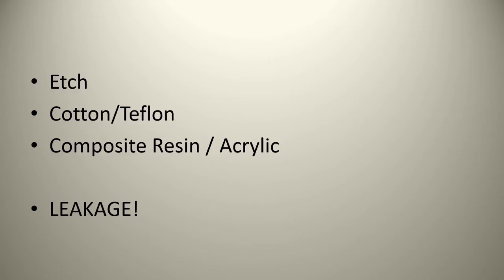So those of you who have placed a few implants, now you'll notice that sometimes when you drill those composite plugs off and you take those cotton pellets or some of the other items that are inside out, they have got a weird sort of stink to them. And this doesn't occur with things like Teflon.